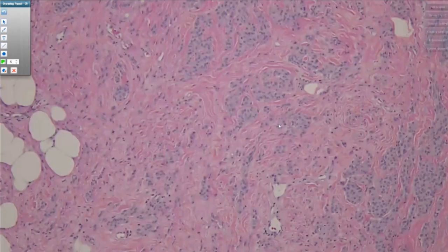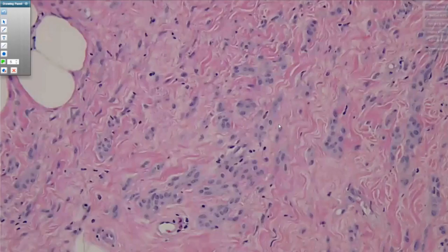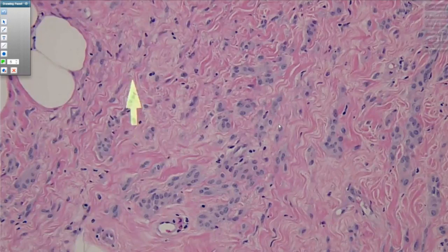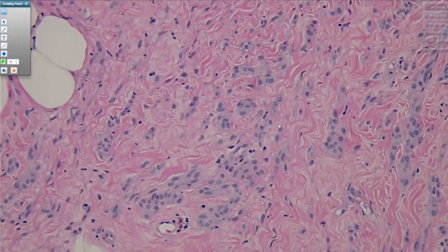In particular, if you look back at the original lesion that I showed of a classic myofibroblastoma, in some areas the cells seem to single file and look rather plump and epithelial, and taken in isolation, the differential certainly could be an invasive lobular carcinoma. And if that's your leading differential and you put an ER immunostain on it, it'll be positive.